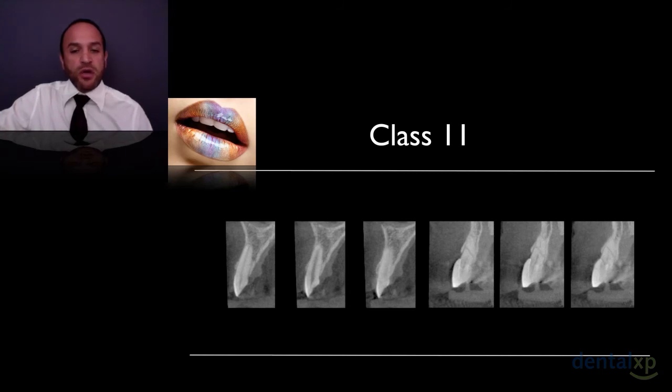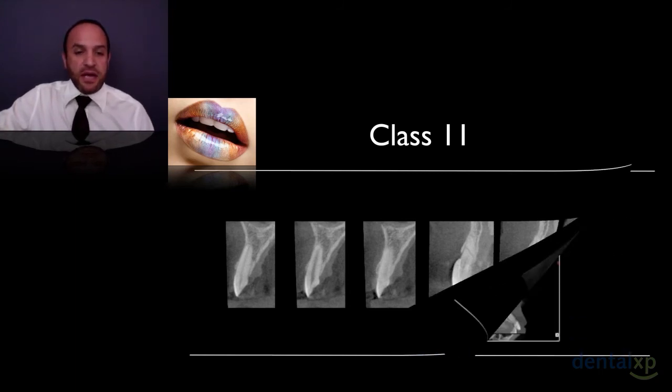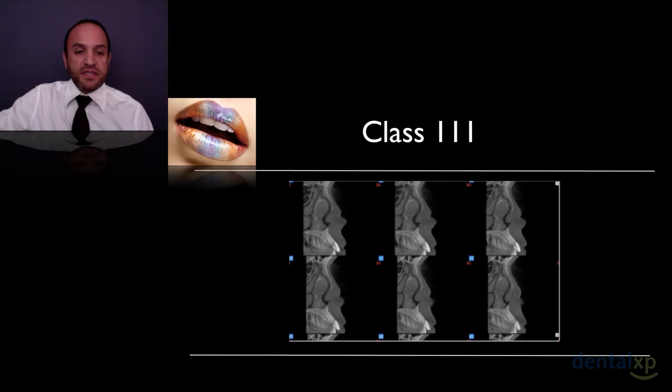But as soon as we go to class 3, even though it's a little small, you can see the crown is now sitting outside the buccal bone, and the root is sitting inside the buccal bone. Here, when you extract the tooth, you are going to end up with very, very thin buccal bone around the coronal portion of the neck of the implant, and that's where our bundle bone is and where we're going to get more resorption. So class 3 is perhaps a case where we shouldn't be doing immediate placement, whereas class 1 and 2 certainly are.